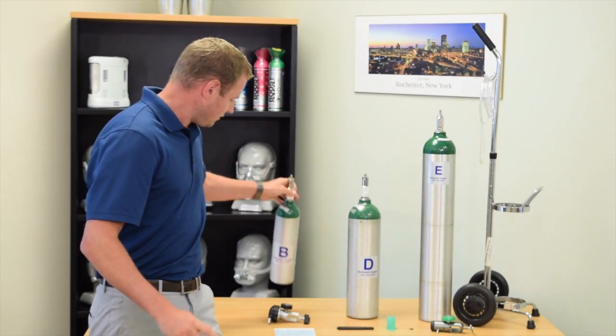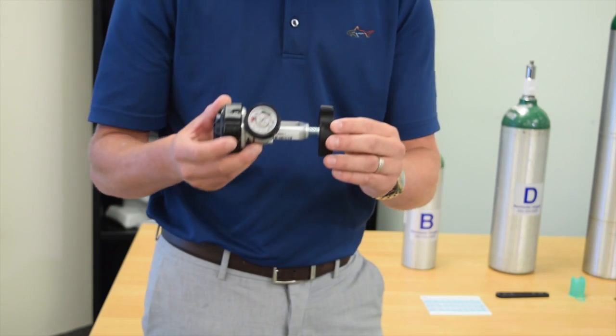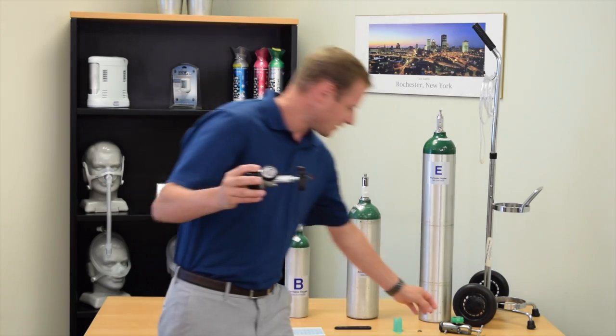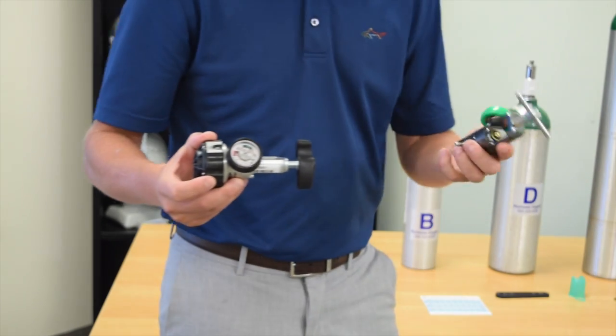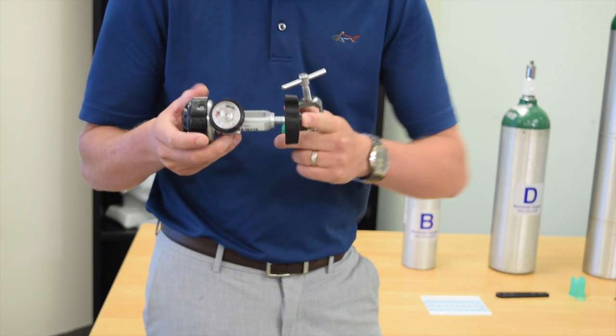The conserving device, which looks just like this, is a special type of regulator used with the smaller style tanks. It is a little different than the standard oxygen regulator. This device is typically prescribed to you by your doctor.